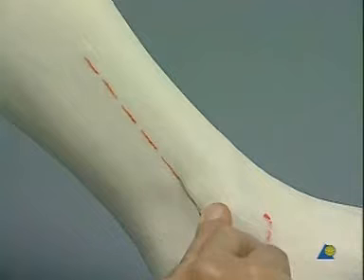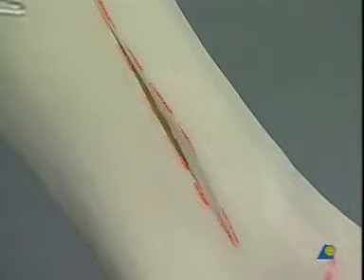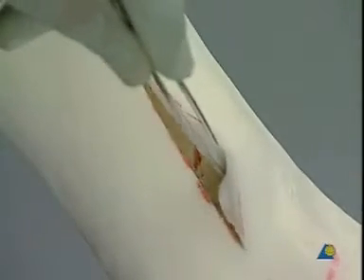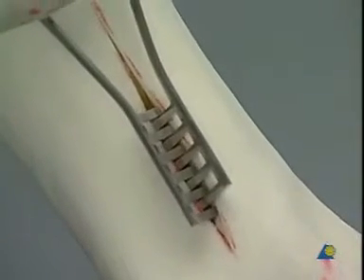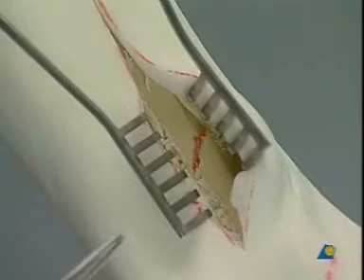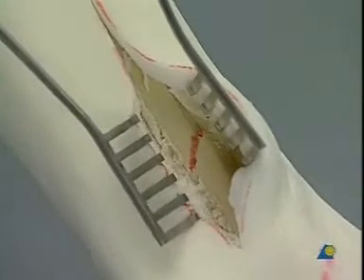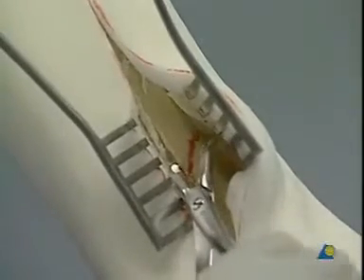The foam does not cut easily. You will notice that you also need to cut through a periosteum-like sheath to get to the bone. To facilitate exposure, wound spreaders have been added to the instruments. If some foam has penetrated into the fracture gap, it must be removed, just as we would clear the fracture gap from hematoma and debris. The shortened oblique fibula fracture is gently reduced with the small tooth reduction forceps.